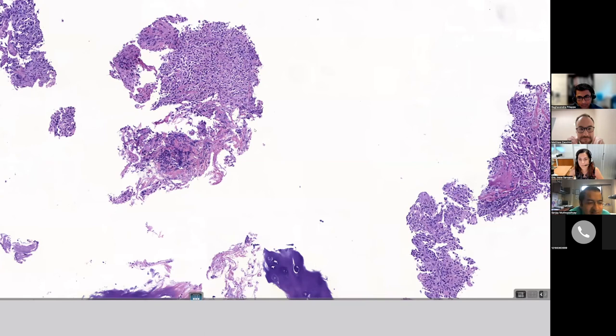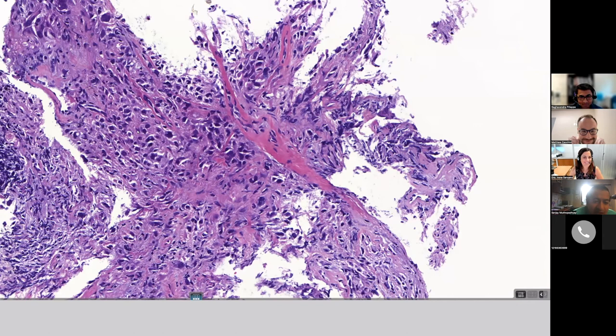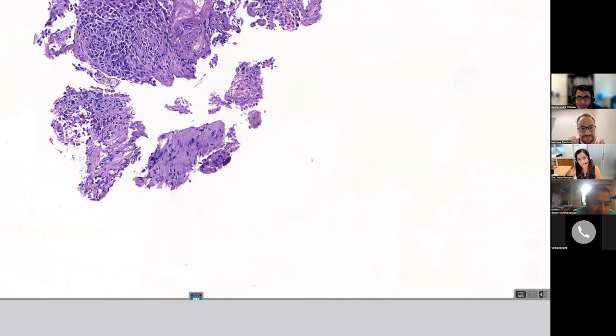Okay, can I go first? Go for it. Sorry, I'm always accused, since my early residency days, of jumping to conclusions too quickly, but that's just my style. Anyway, the idea here is that, to me, this is a clearly high-grade malignant neoplasm. And there is a hint to me, at least, that the cells are very poorly differentiated, or almost sarcomatoid looking. So my first thought here would be, could this be a sarcomatoid carcinoma? That's my first impression.